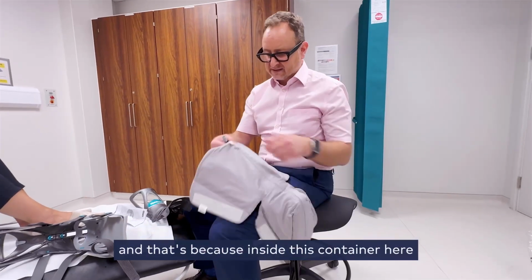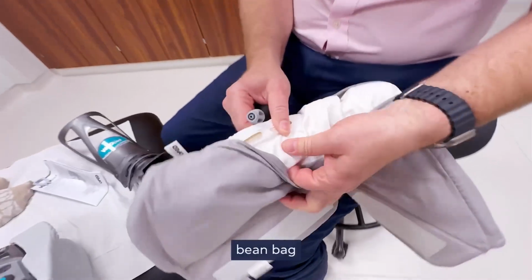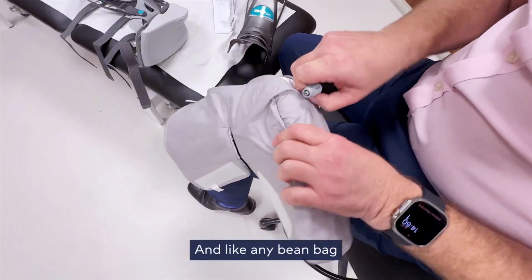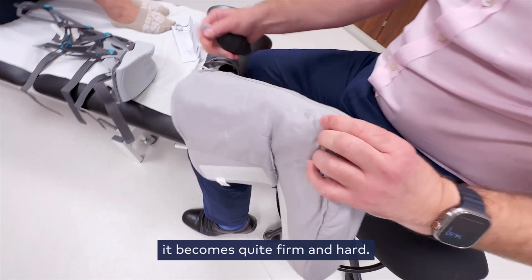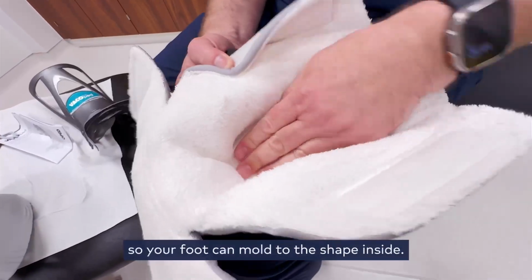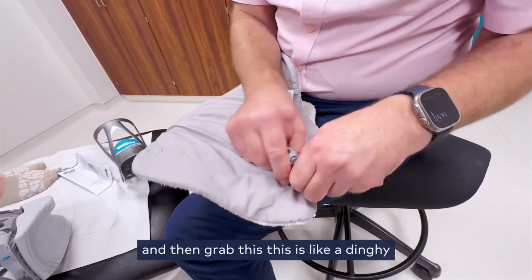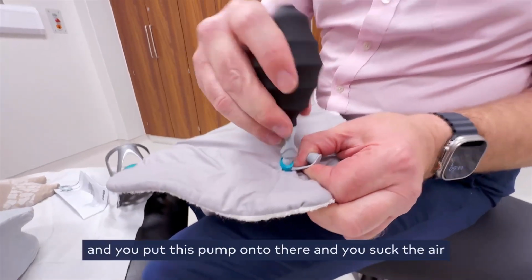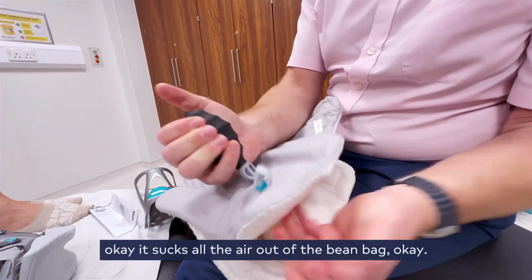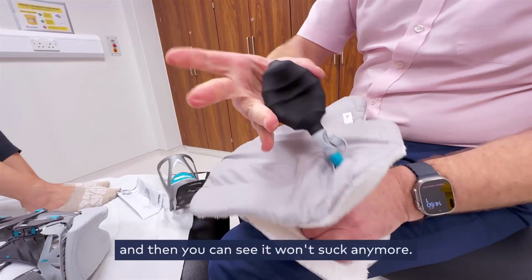That's because inside this container you've got a plastic bean bag, effectively, a big bean bag that sits inside here. And like any beanbag, if you suck the air out of it, it becomes quite firm and hard. So this is all nice and soft here, so your foot can mold to the shape inside. If you hold it there and then grab this, which is like a dinghy pump, and put this pump onto there and suck the air, it sucks all the air out of the beanbag. We're going to suck it a little bit more, and then you can see it won't suck anymore.